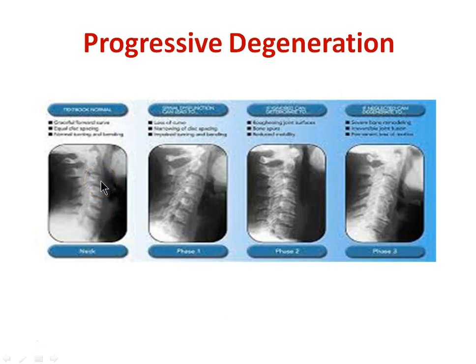Now, you can understand this, so I just want to get your attention for a minute. When we look at your x-ray, what we're going to ask ourselves is, do we have the proper banana-shaped curve? Do we have good disc height? And are the borders of the bones well defined? So this is normal. Three things we're looking for: a good banana-shaped curve, good disc height, and well-defined borders on the bones.